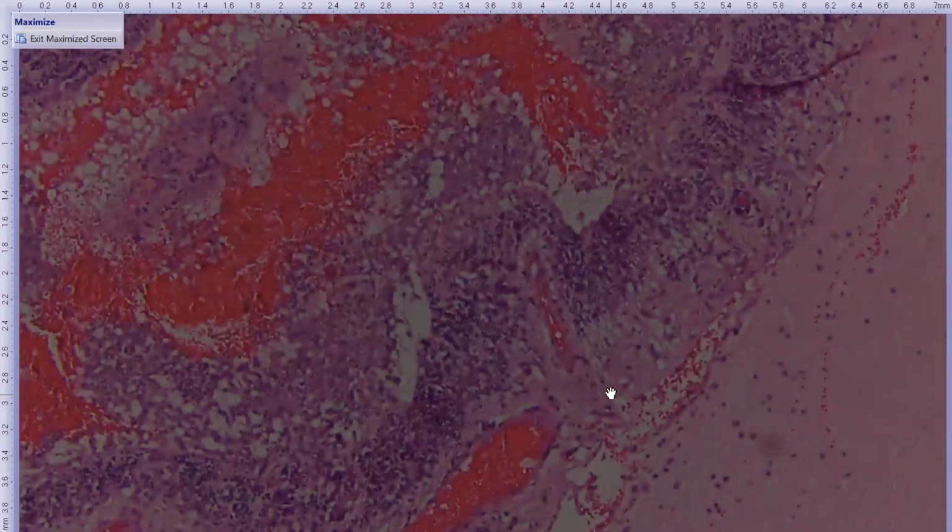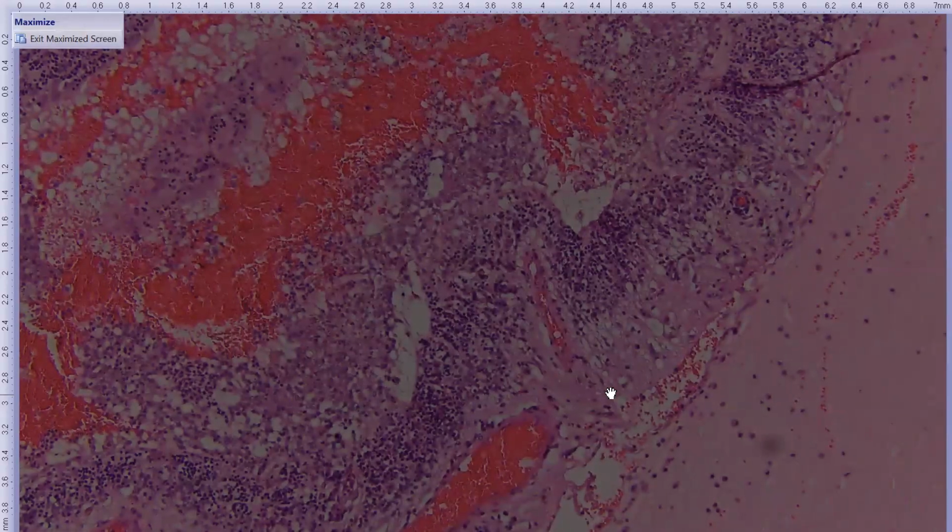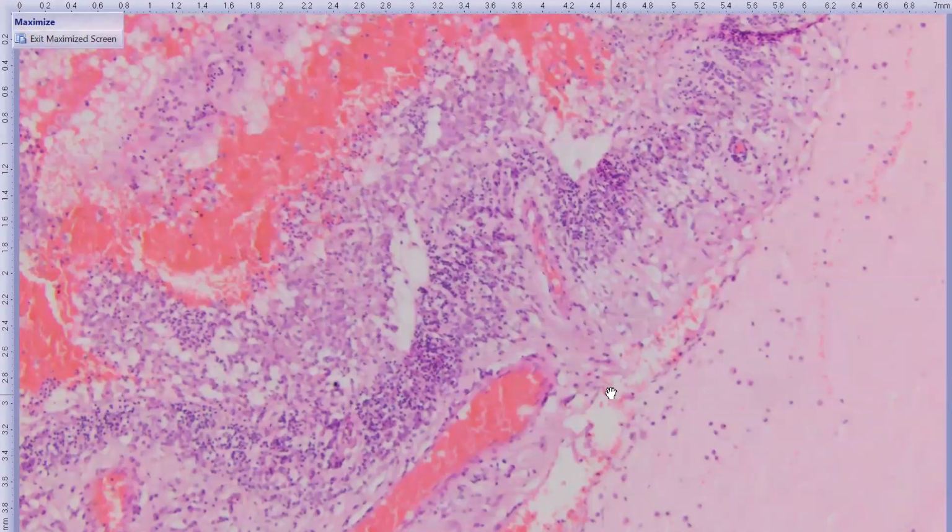And, oh, it kind of looks like the exposure has gone back to, unless, nope, okay, good. It would help if I put the condenser in.